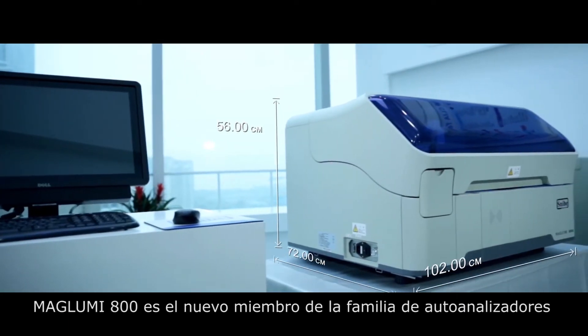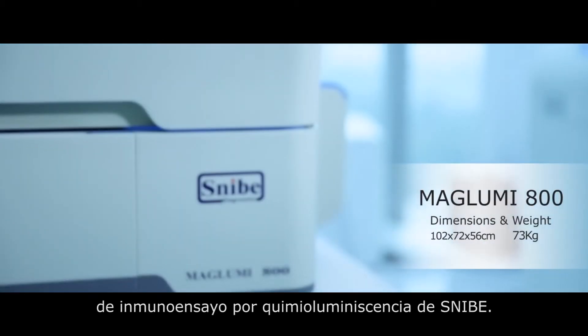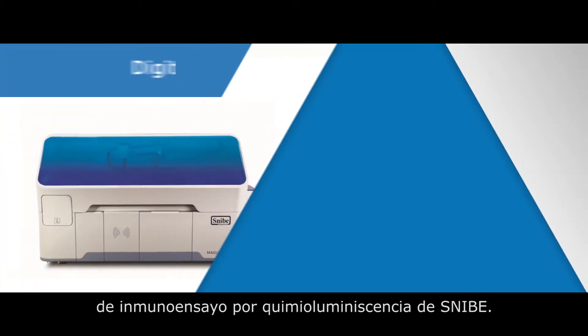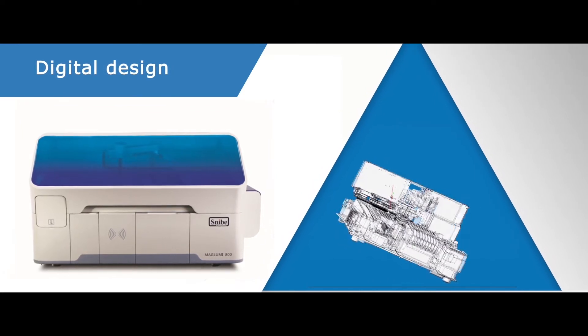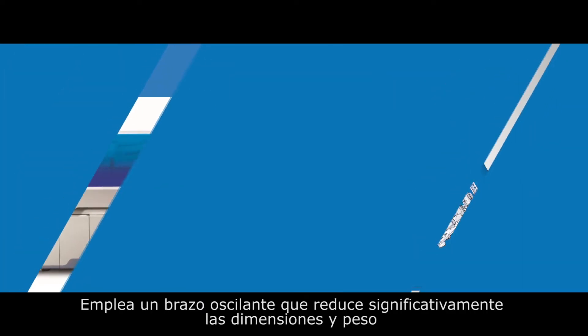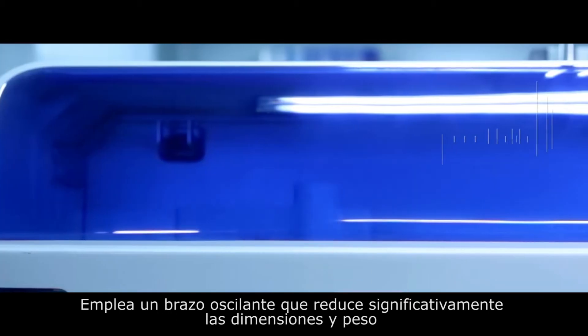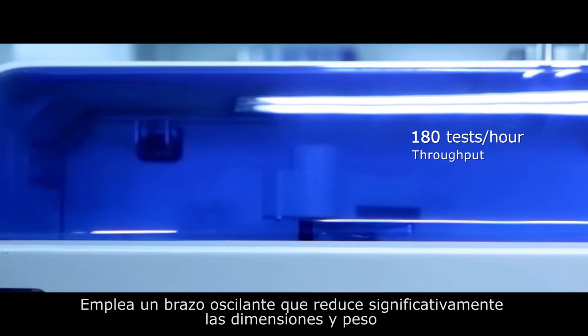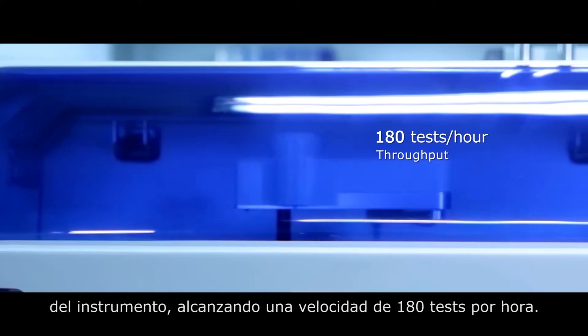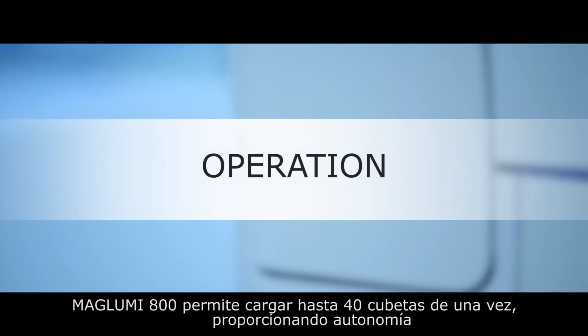Maglumi 800 is a new member of Snibe's Maglumi series of fully automated chemiluminescence immunoassay analyzers. It uses a swivel arm design which significantly reduces analyzer size and weight, while still maintaining a throughput of 180 tests per hour.